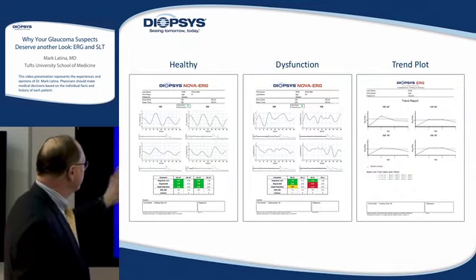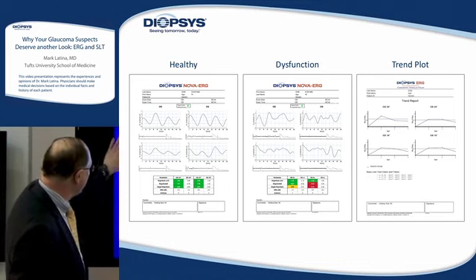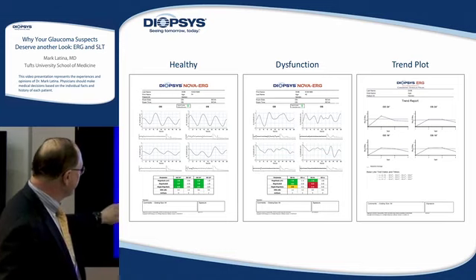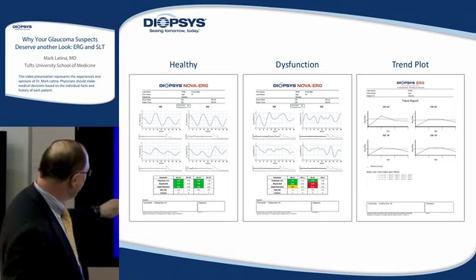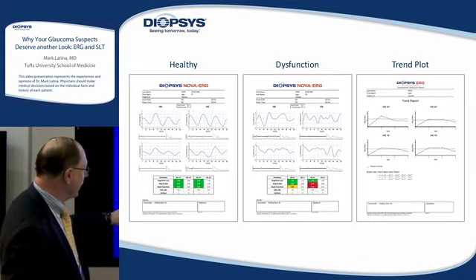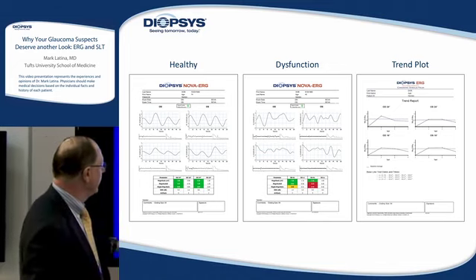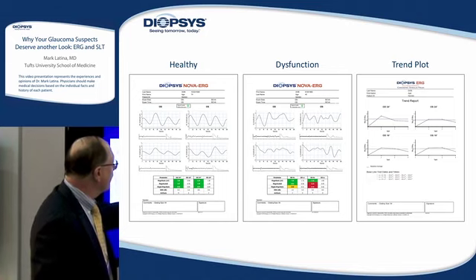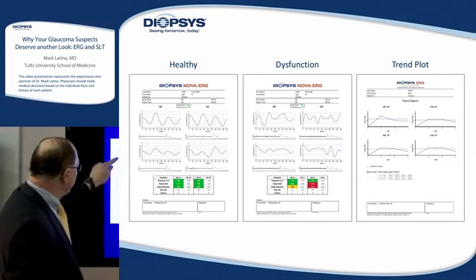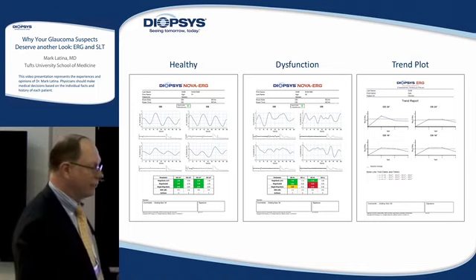So here's basically what the report looks like. So you do the test. This is a normal, healthy pattern electroretinogram looking at three measures: the magnitude, the magnitude D, which I'll go over, and the magnitude D ratio. It is color-coded. There is a normative database. This is a dysfunctional pattern electroretinogram. Also, what you want to see is these nice sinusoidal patterns. So this means that these cells are all sort of overall healthy. They're in sync. They're working together.